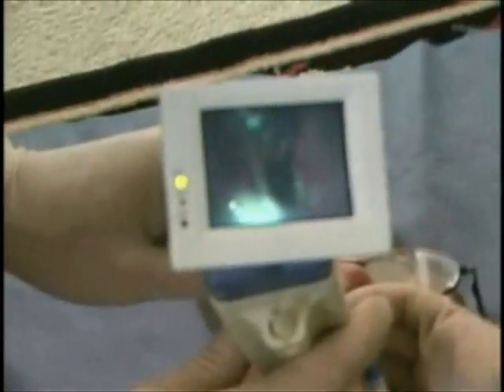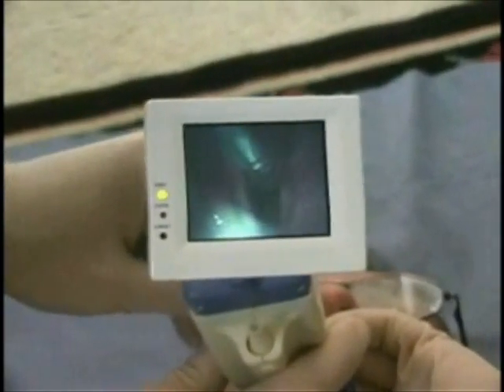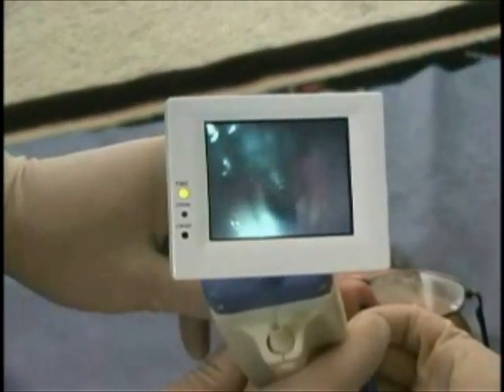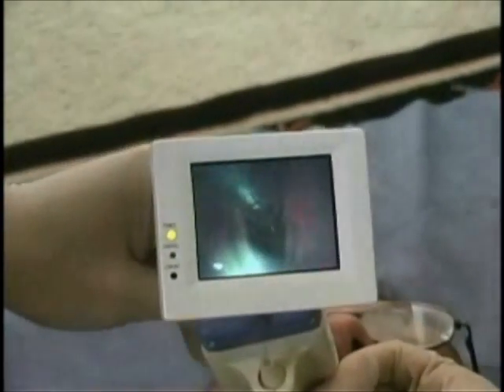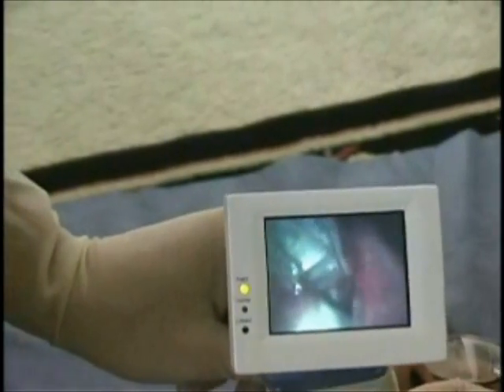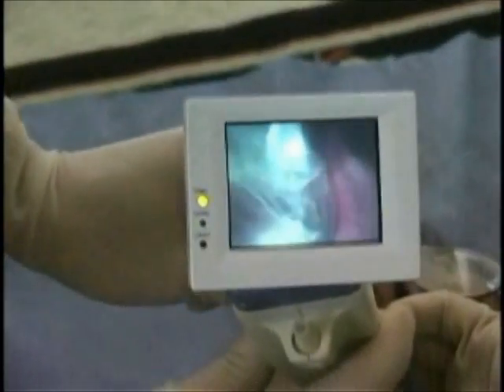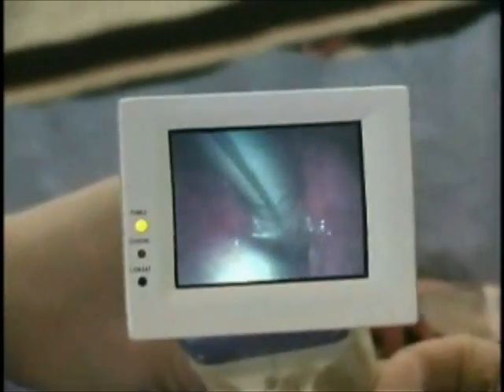Hold the rescue scope firmly in place. The endotracheal tube is gently pushed out of the loading channel and introduced in between the vocal cords into the tracheal cavity. Always hold the tube a short distance from the entry point so it does not bend while it is pushed forward into the tracheal cavity.